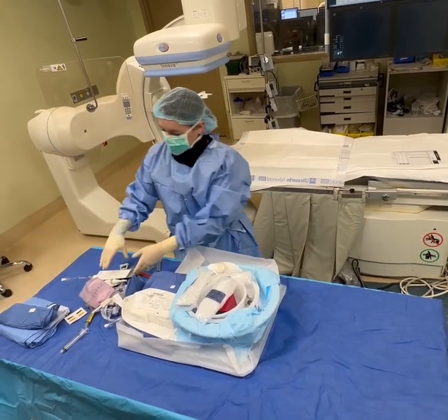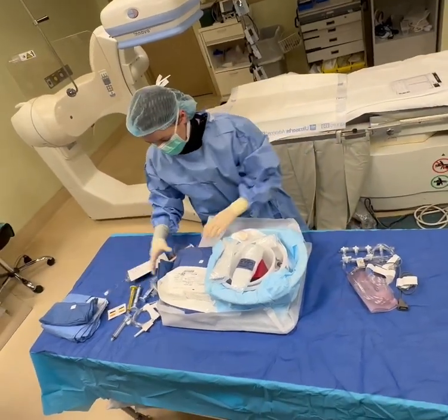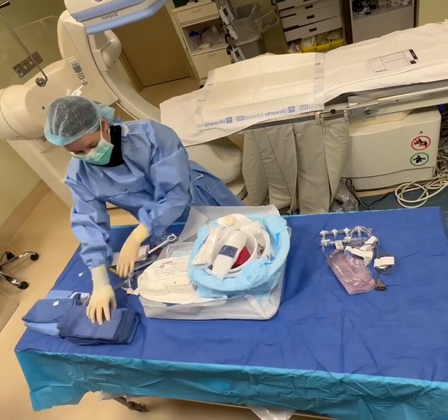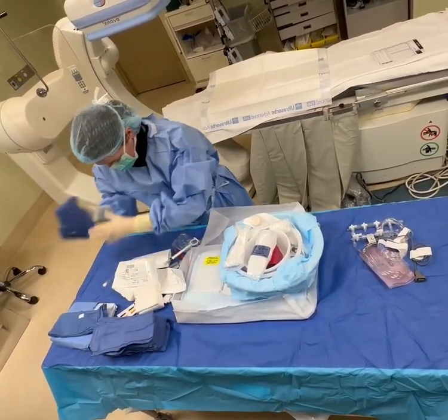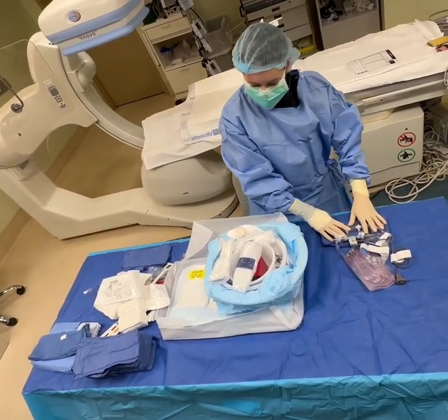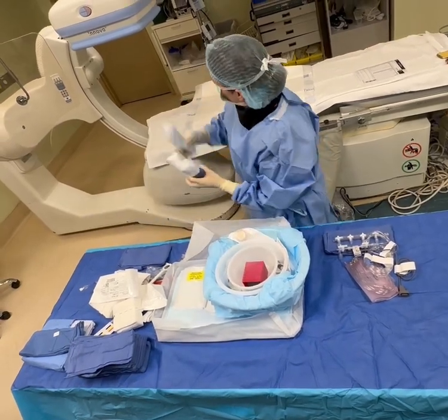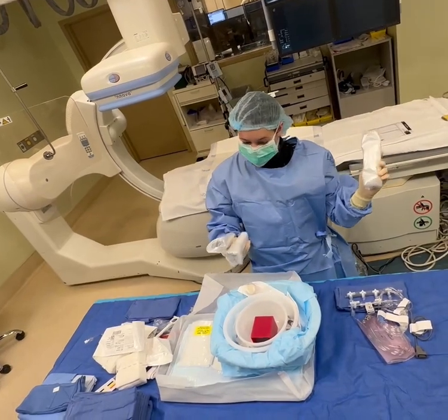All right, I'm going to move all this over here. This is how I set my table up. I'm going to take all these extra towels and put them here for now. I know I keep one for here for my access little kit, one for here for flushing my manifold, okay? These are going to be your x-ray shields. They're going to throw the x-ray shield, and then one of these is going to be my trash bag, okay?